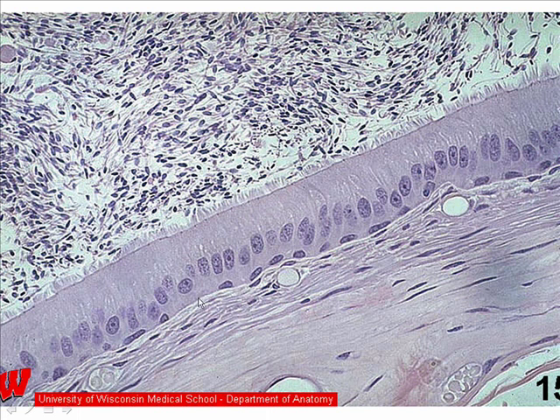And as you will learn about shortly, this epithelium sits on a connective tissue layer, which is underneath it. Note that there are a couple of blood vessels here, which come right up next to the epithelium. This is necessary because epithelium in and of itself is avascular, and it receives all of its oxygen and nutrients from the blood vessels below. And the initial layer of this connective tissue is what we will define as a loose connective tissue layer, which is cellular and contains small blood vessels, whereas just below that we have a more dense connective tissue layer.